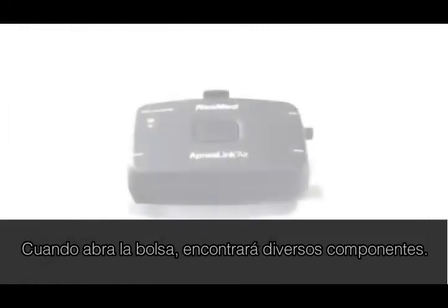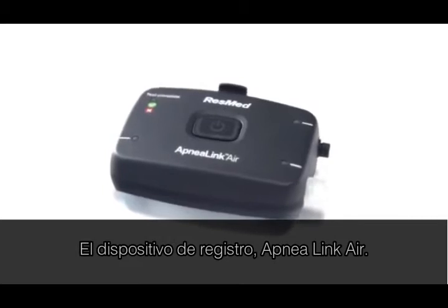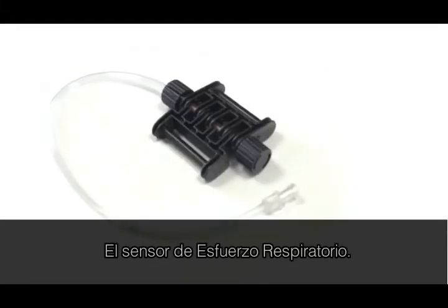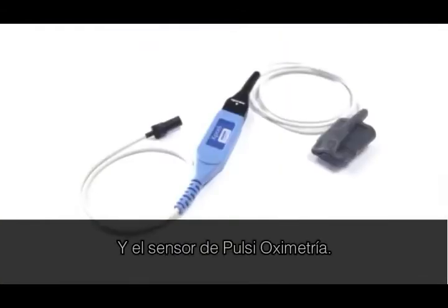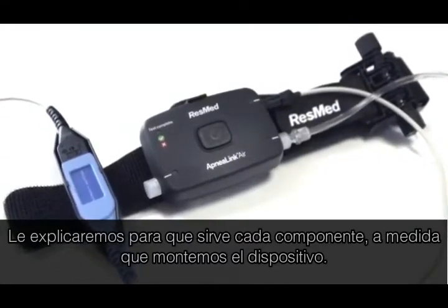When you open the pack, you find several components: the ApneaLink Air Recorder, the belt, its effort sensor, the nasal cannula, and the pulse oximeter. We'll explain each of these parts as we assemble the system.